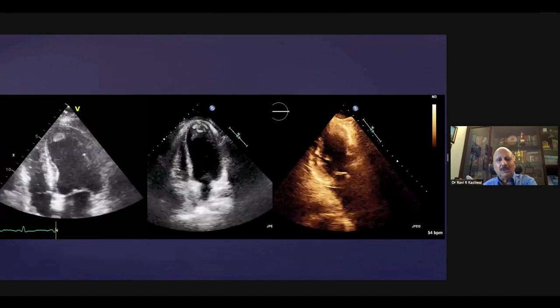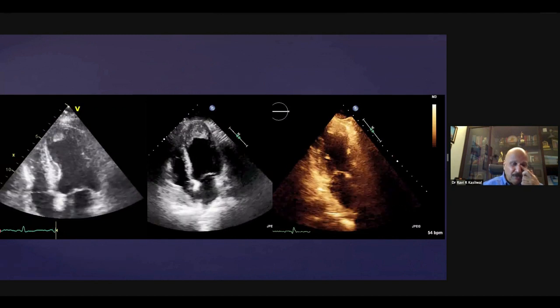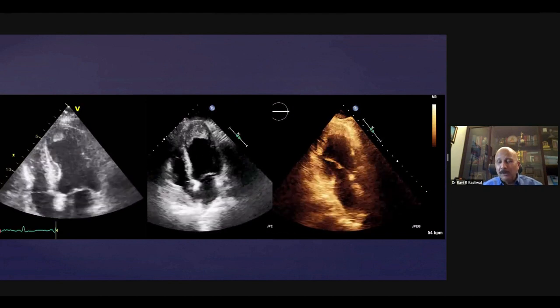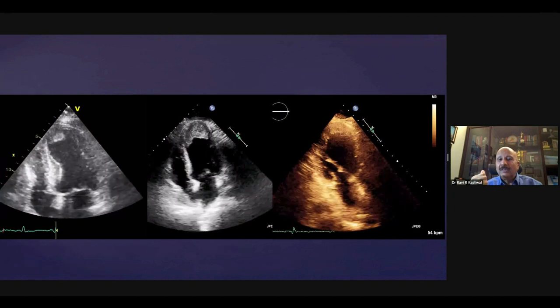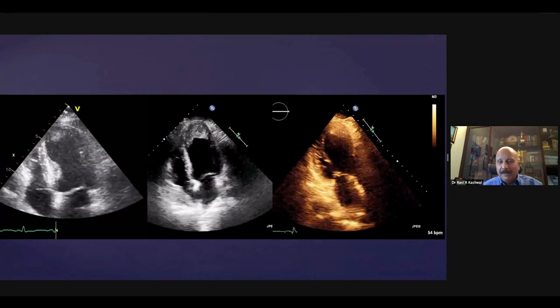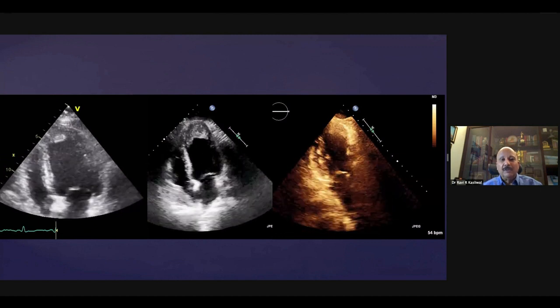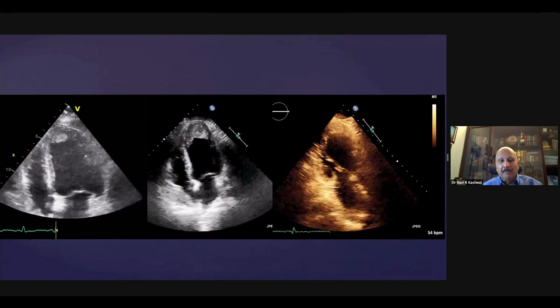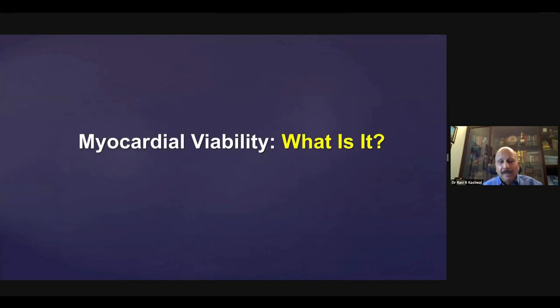And here, I'm just showing a plethora of cases in which, in coronary artery disease with wall motion abnormalities, you can actually see thrombi. Some of these patients may not present to you. Some of these patients may actually present to the neurology service. And then when they ask for an echo, then you realize that they were actually harboring in the apex a thrombus.